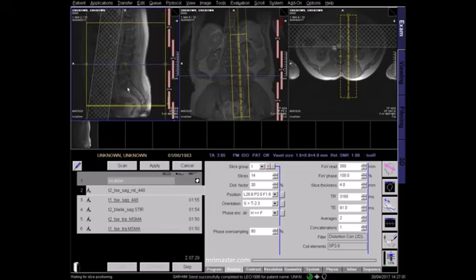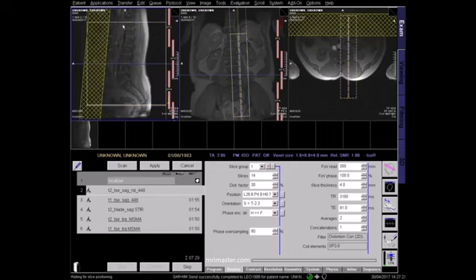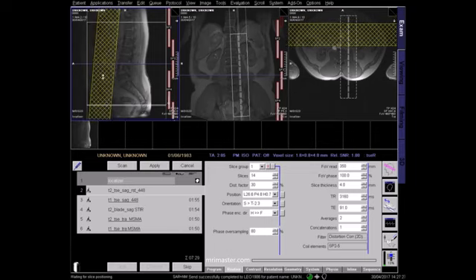On the sagittal localizer, the field of view should cover the sacrum inferiorly and T12 superiorly. Bring the saturation band close to the vertebra to eliminate artifact from respiration and pulsation of the abdominal vessels.